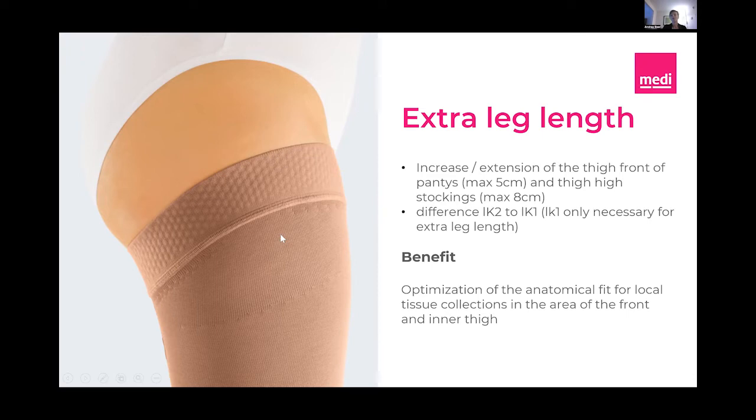But a lot of lymphedema clients need a little more length right on the front of the thigh, also going into the inside medial side of the leg, because there is a little bit of a tissue lobule, or there's soft tissue there. So a lot of my clients ask me, hey, can you make the stocking longer so that I can tuck in this little tissue?